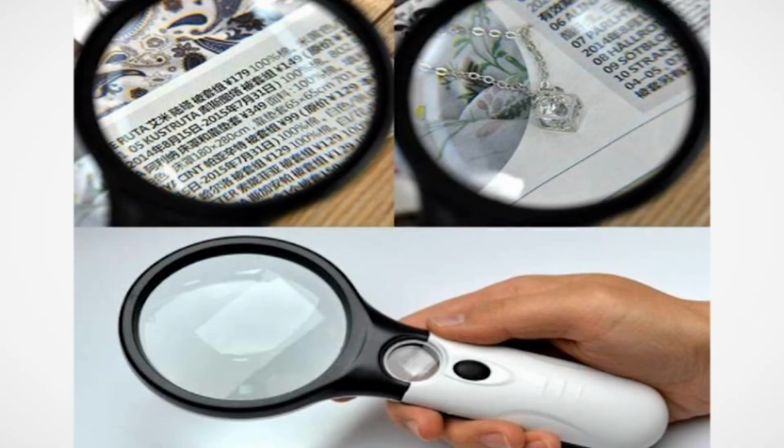They can be difficult to use for children with limited dexterity or hand tremors. They provide a limited field of view in comparison to spectacles. They are somewhat less effective than spectacle frames with the same power.